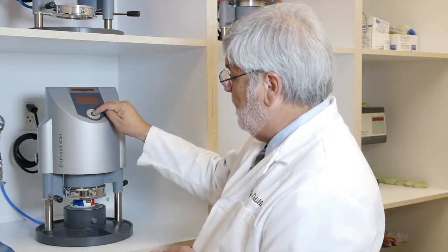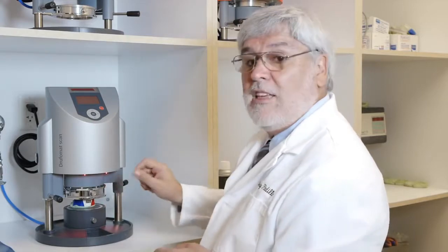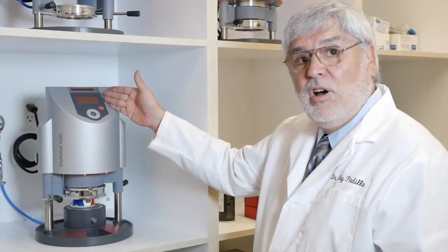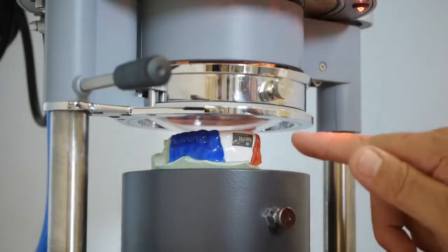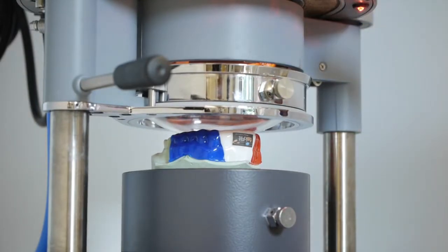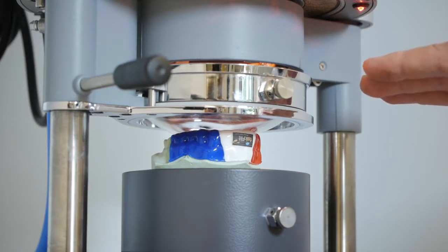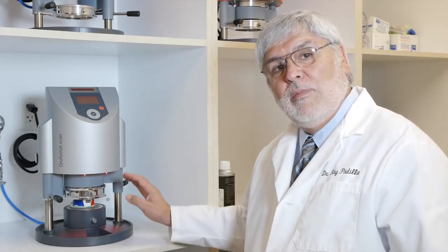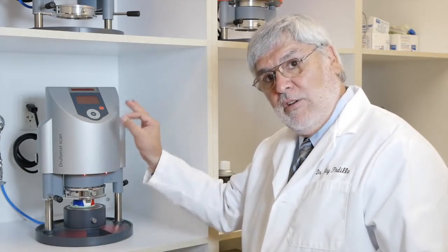Everything is lined up directly. Press OK. The lights are now on. The heating element has begun. We have 1 minute and 15 seconds left to go in the heating out of the 3 minutes. And if you notice, you're starting to get the drooping or the softening of the EVA material. It will be so hot that it'll actually touch the model. That's good. We want it that hot. We have 30 seconds to go.